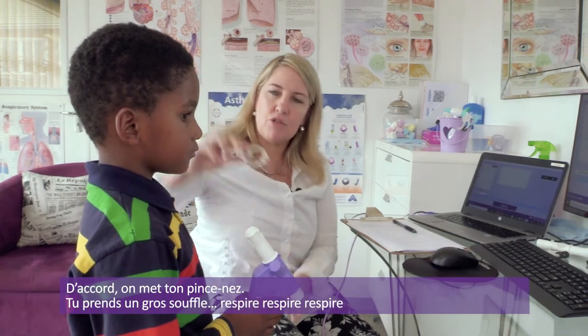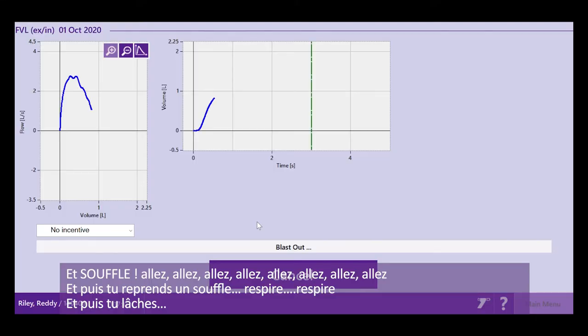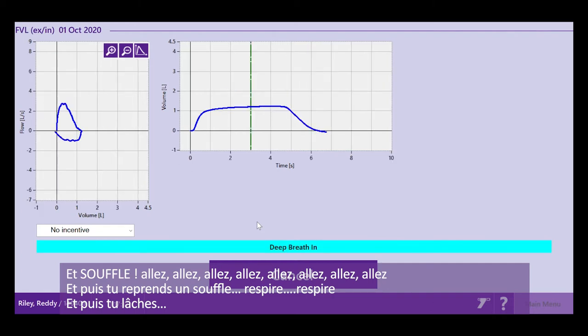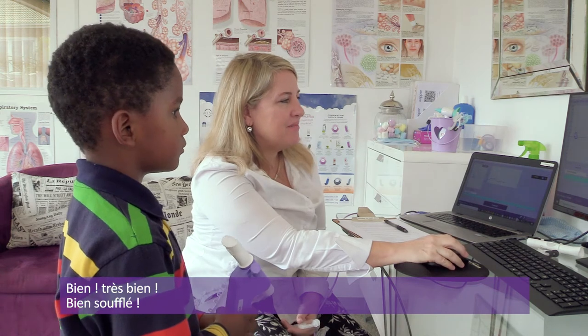All right. Let's put your nose clips on. Okay, a big breath in. Fast as you can. Go, go, go, go! And breathe in, breathe in, breathe in. And rest. Okay, take it out. Well done. Good. Very good.